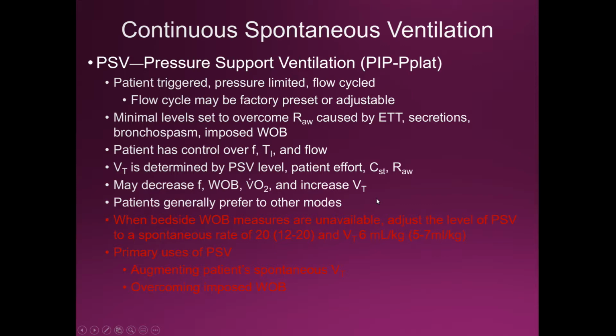So that's where I'm going to need a pressure support to maintain that. So I'm getting a workout with my diaphragm. My neurons are firing to the point where it's going to contract the diaphragm in a manner that either I was at before I was sick and got intubated, or at a better tidal volume than when I was starting to breathe on my own.